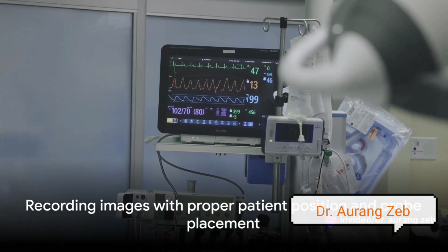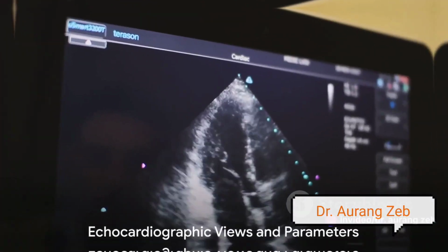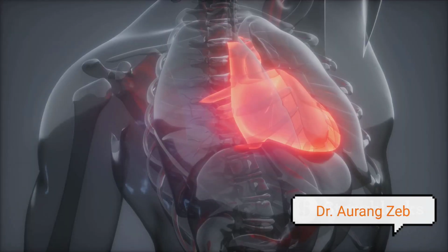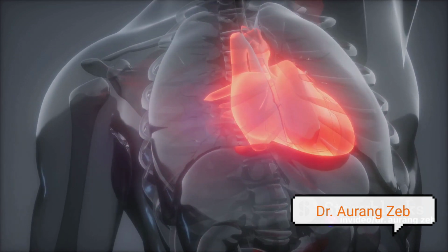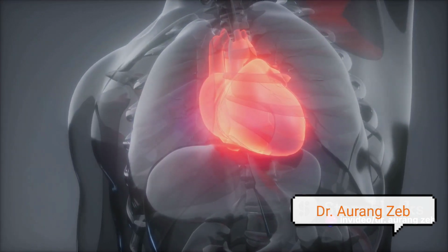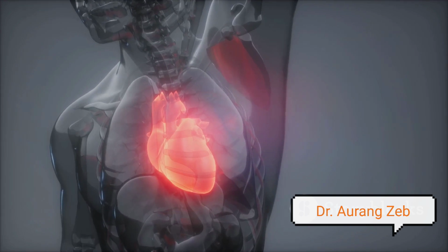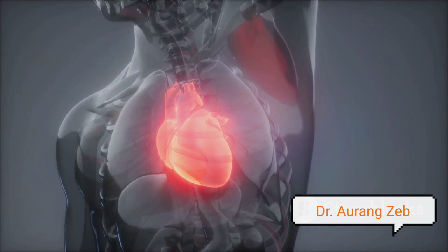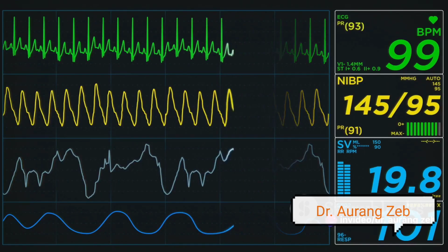With the patient comfortably positioned and the probe placed, we can start recording images. A comprehensive echocardiogram includes several standard views. Diving right in, we'll start with the parasternal long-axis view. This view offers a cross-sectional image of the heart. We can see the left ventricle, the right ventricle, the aorta, the left atrium, and the mitral valve. Here, we measure the size of the aortic root and the left atrium and assess the function of the mitral and aortic valves.